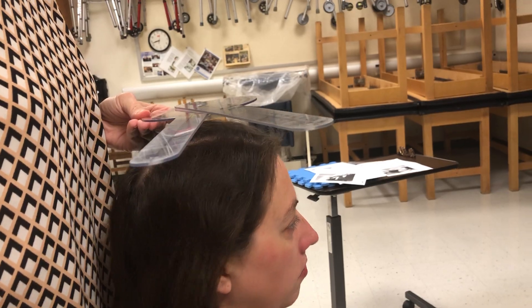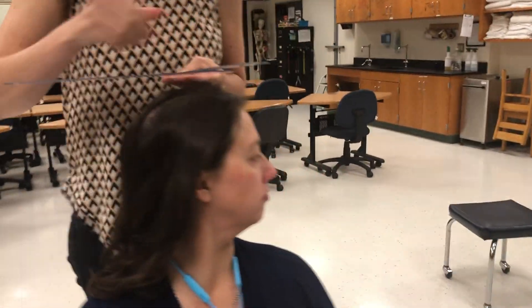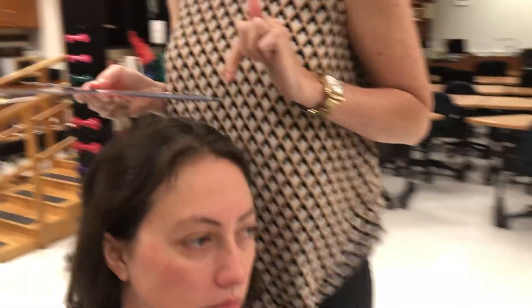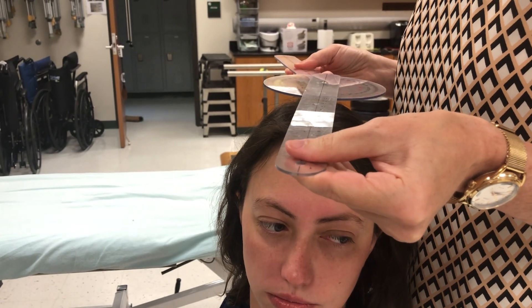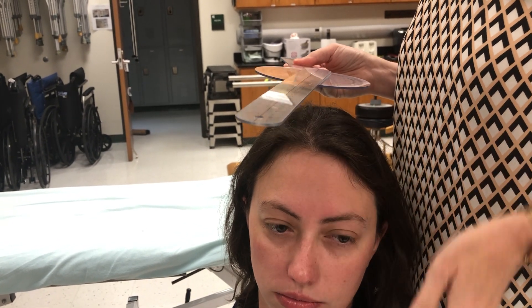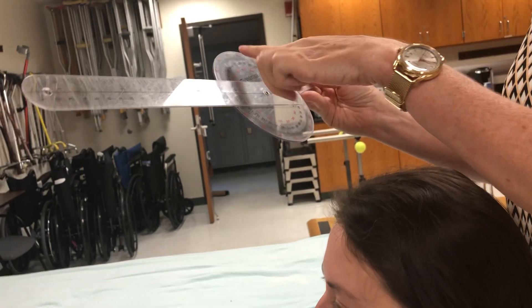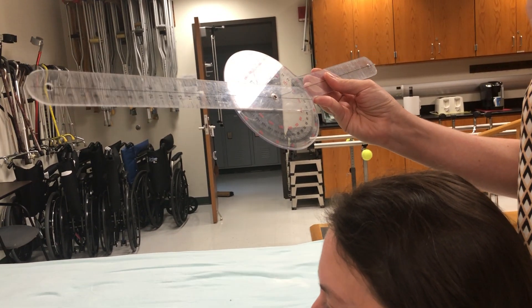Now I'm going to have you look over your left shoulder as far as you can. Her nose was straight ahead, that's where she started. I make sure my fulcrum is over the center aspect of the head and double check that my stationary arm is parallel to that black line on the floor. I bring the moving arm right over the tip of her nose. I'm measuring from zero and she's getting about 74 to the left.